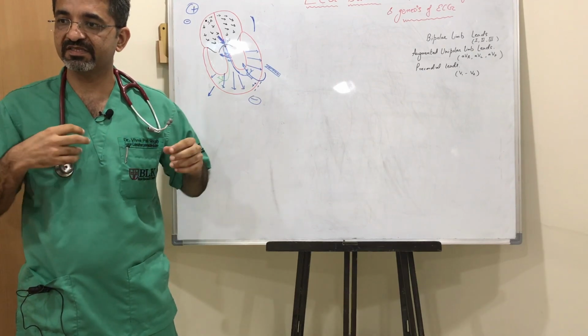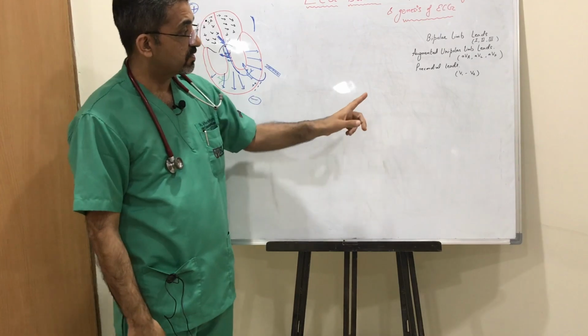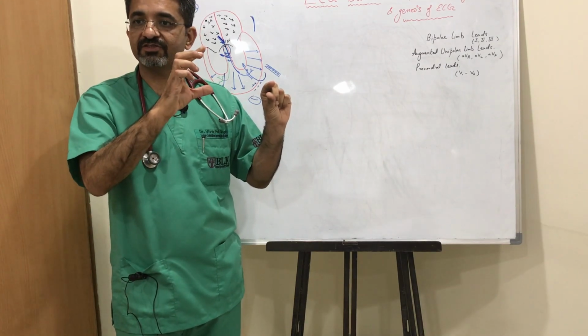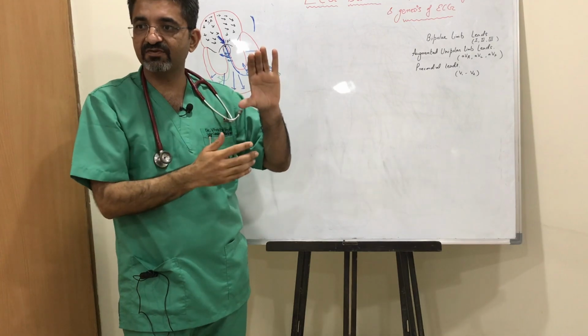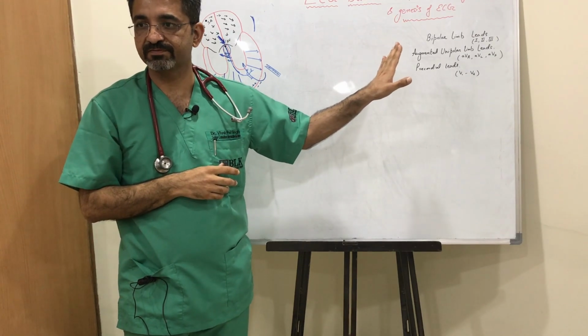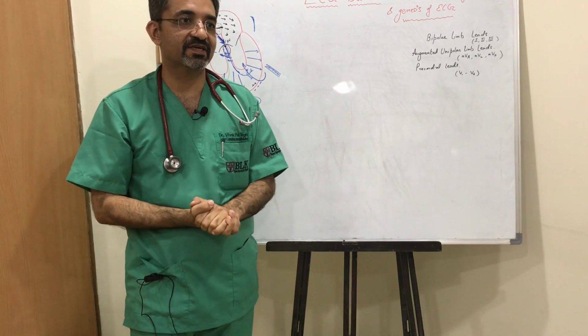They are unipolar. These are their positive electrodes. The negative electrode is at the right foot. You should know the R/S progression. The R wave is small in V1 and it grows larger to its maximum amplitude in V6. Similarly, the S wave is deepest in V1 and it slowly diminishes to a minuscule state at V6. I think we stop the lecture now and we'll see you again next time.